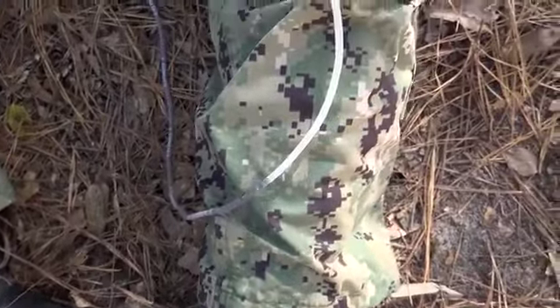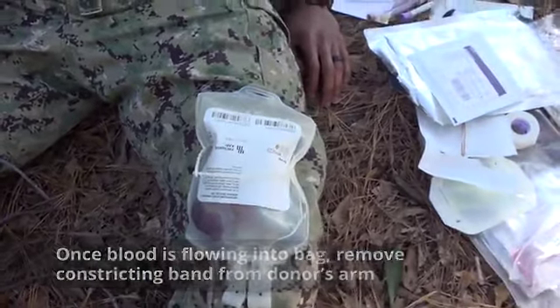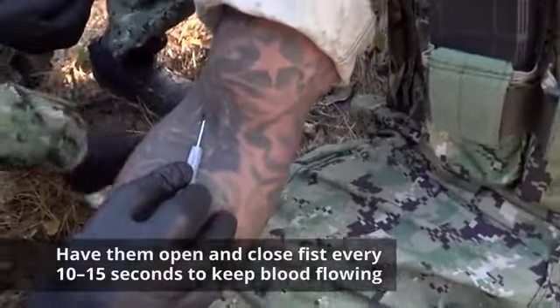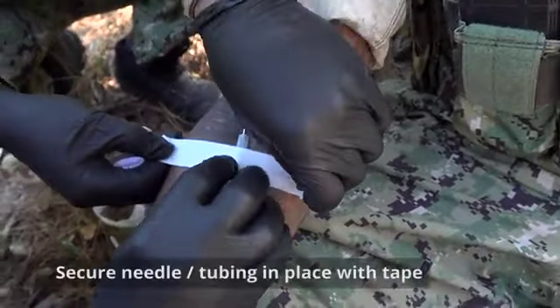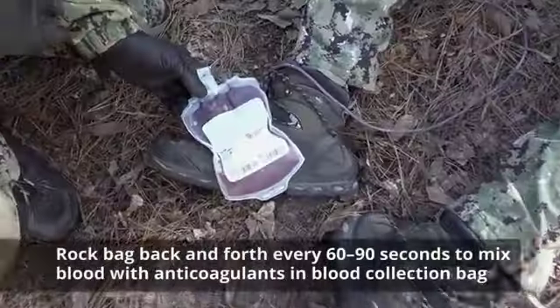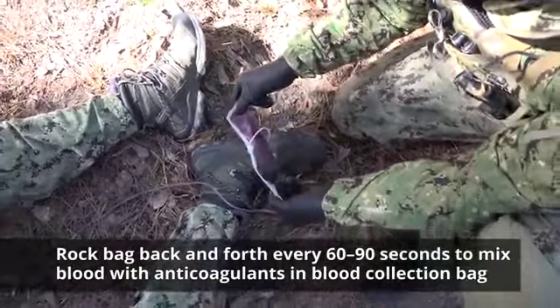Visualize to ensure the blood is flowing into the blood collection bag. Once the blood is flowing, remove the constricting band from the donor's arm and ask them to open and close their fist every 10 to 15 seconds to keep the blood flowing. Secure the needle and tubing in place with tape. Rock the bag back and forth every 60 to 90 seconds to mix the blood with the anticoagulants in the blood collection bag.